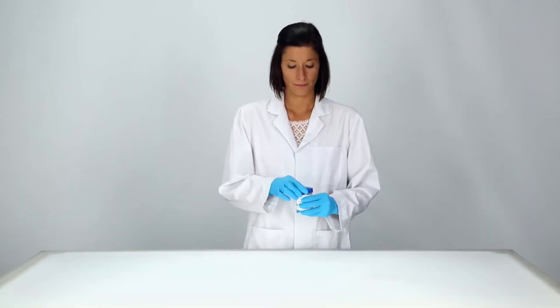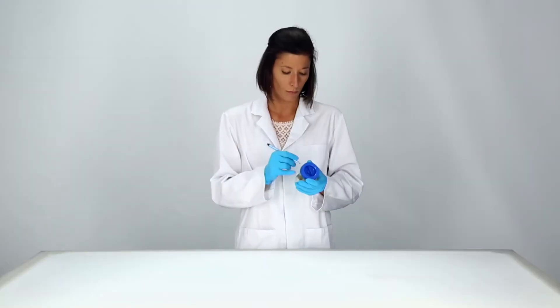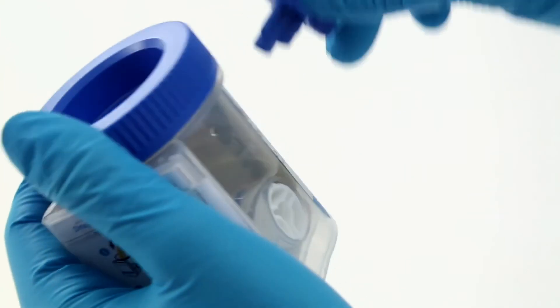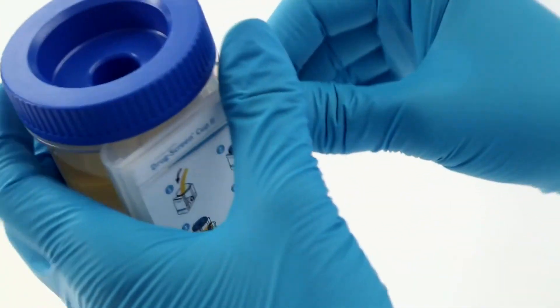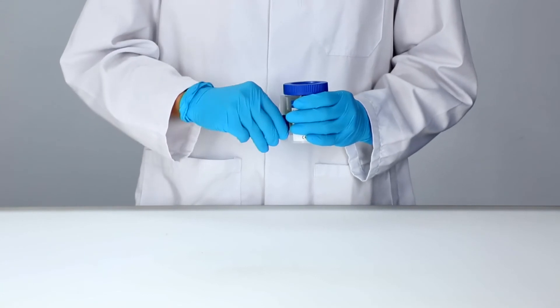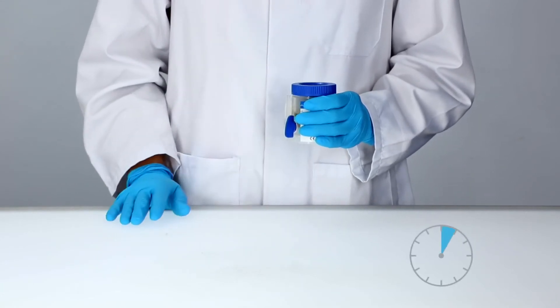Secure the lid before starting the test. Fill in the patient's details on the label. Remove the key from the lid, put it in the keyhole provided and turn it 180 degrees clockwise. Start your timer immediately.